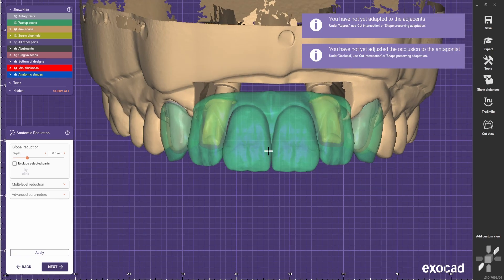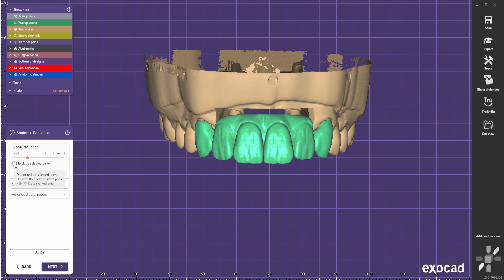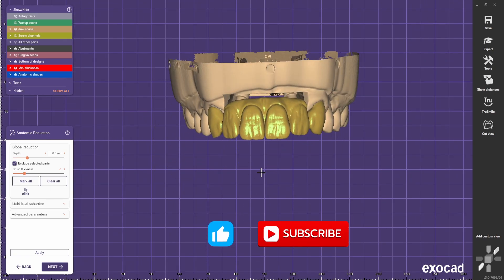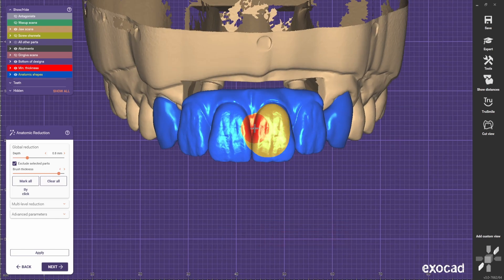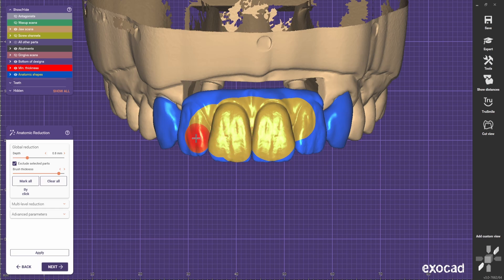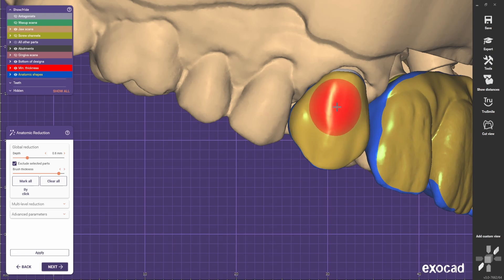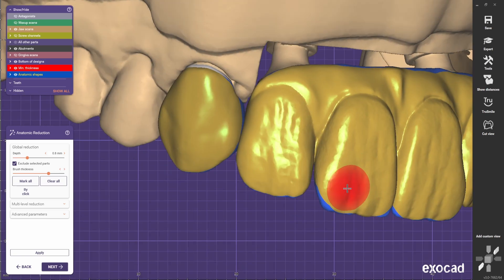Now we're going to do the reduction. I just want to do a buccal cutback, and for that we select 'Exclude Selected Part'. Everything is now yellow. Usually I go 'Mark All' and then paint the part that I want to reduce. Whatever is blue stays full contour, and the yellow part is going to be reduced.